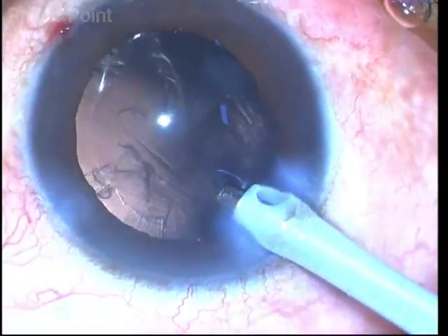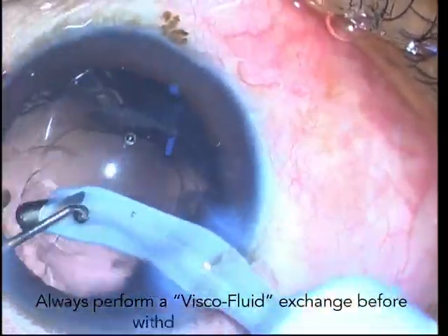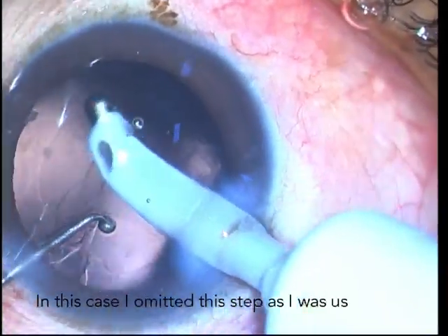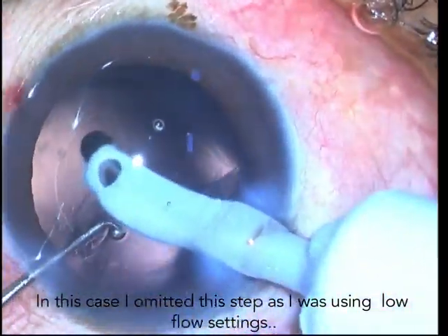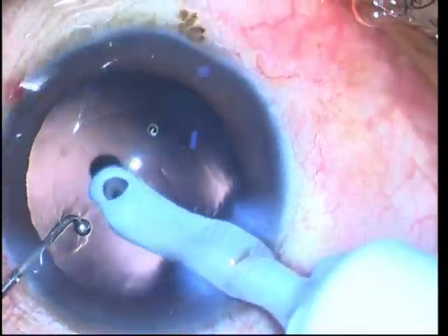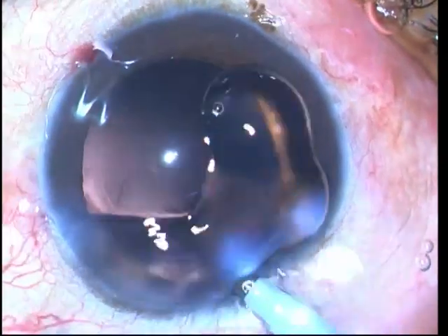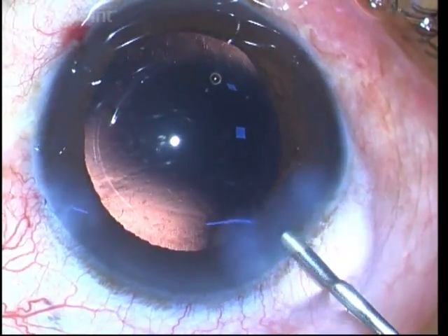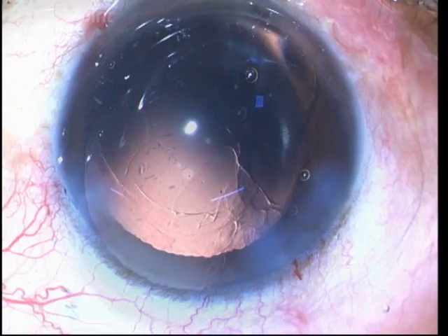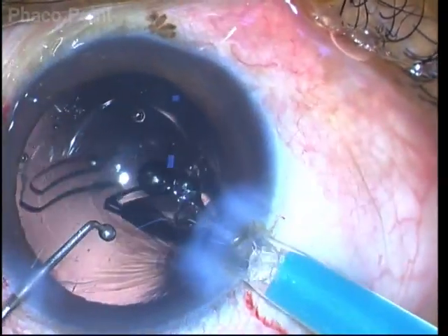Finally, cortical aspiration is done. Before pulling out the phaco probe, it is a good idea to use a visco-fluid exchange — stopping the irrigation flow, putting in viscoelastic, and then coming out of the anterior chamber. However, since low flow parameters were being used, this is sometimes not needed. Most of the cortex is aspirated from the capsular bag, leaving it very clean, with a nice central 5 mm capsulorhexis. The last step is to implant the intraocular lens — in this case, a hydrophilic acrylic intraocular lens into the capsular bag.